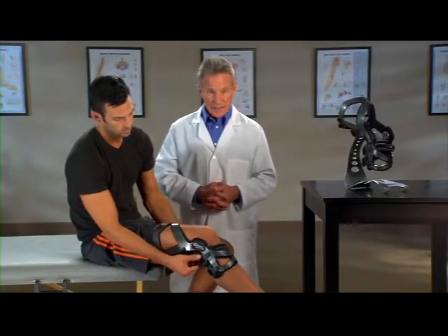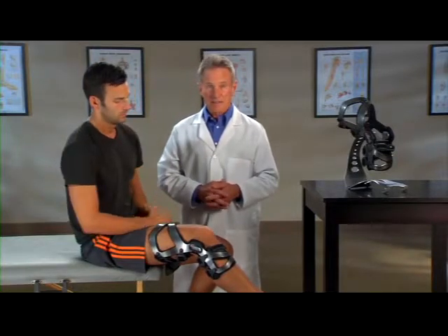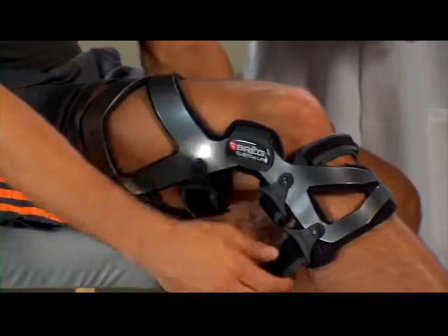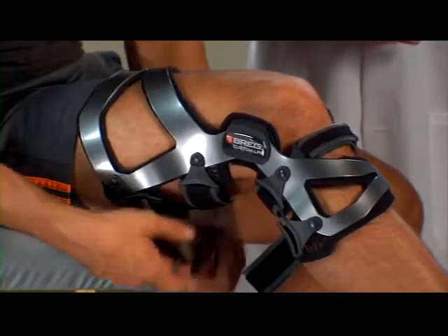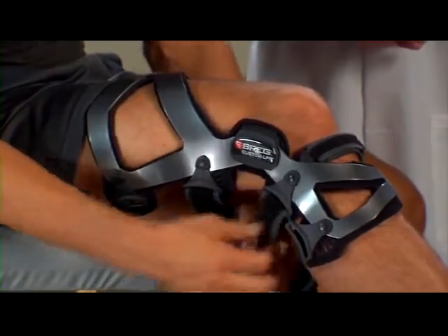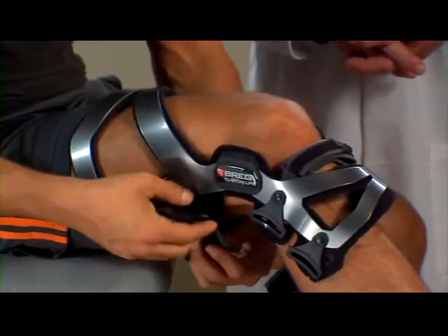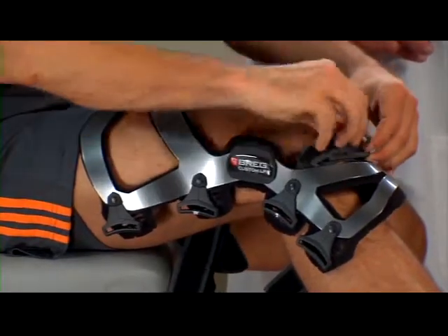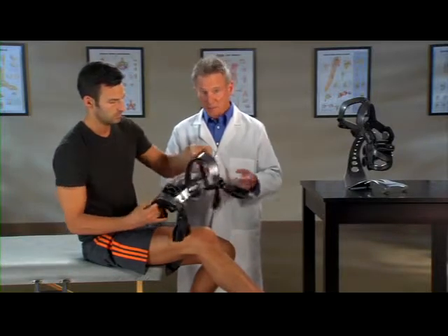For PCL-specific applications, apply all of the back straps first and the front straps last. To remove the brace, unfasten all the straps but just loosen number three. Then remove the brace. Fold the hook-loop tabs back against the straps for easy storage.